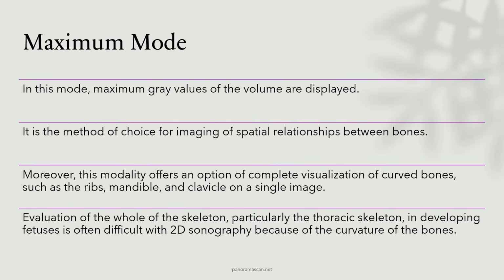Maximum mode overcomes this limitation, providing a clearer view of these bones and their spatial relationships, making it easier to assess skeletal development in developing fetuses. By using maximum mode, clinicians gain better insights into bone development and can more accurately assess the overall skeletal structure of the fetus, including the curvature of bones and their positioning relative to each other.